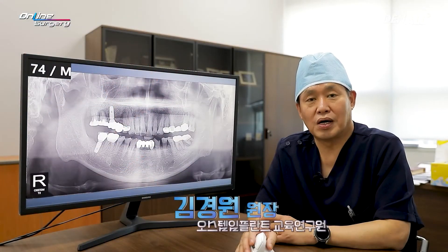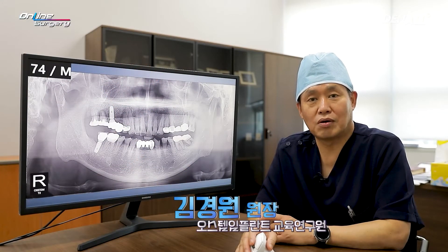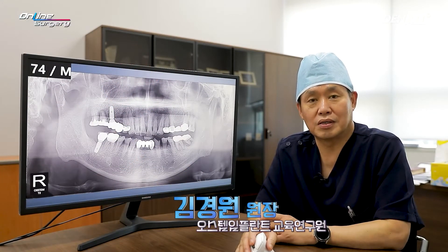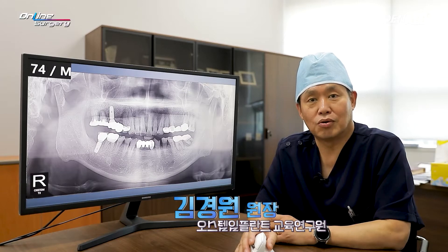Greetings, I'm Dr. Kim Kyung Won. Today we are going to look at a surgical video clip and review the case together.